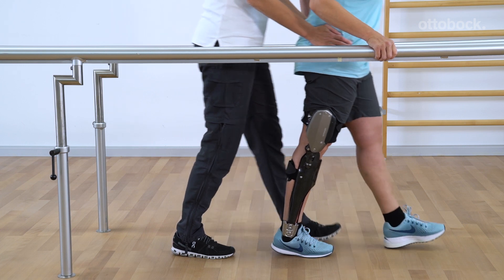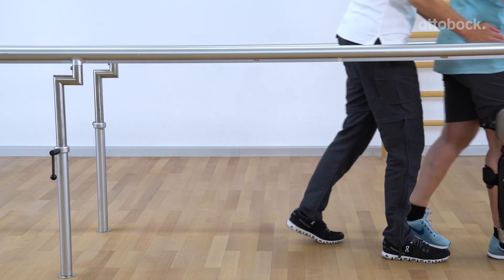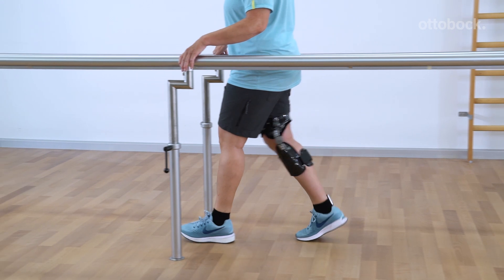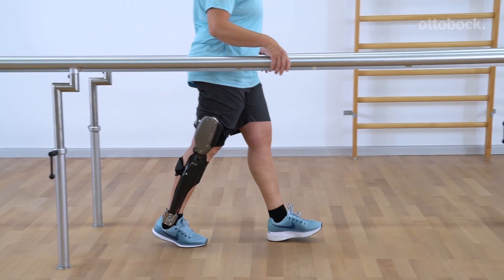This is a basic prerequisite for the stance release. Once the patient is able to complete the motion sequence well and their muscle status permits it, they can practice alone between the parallel bars with the therapist's supervision and gradually reduce the use of the arms.